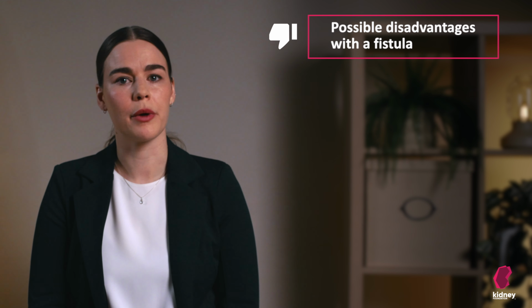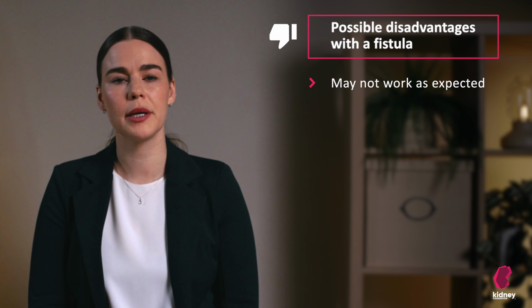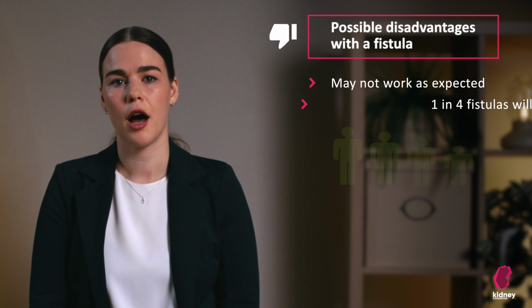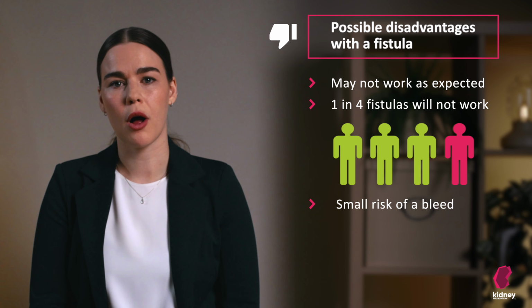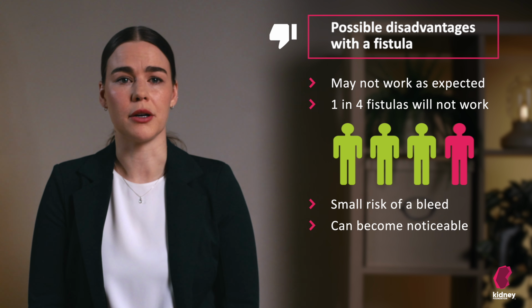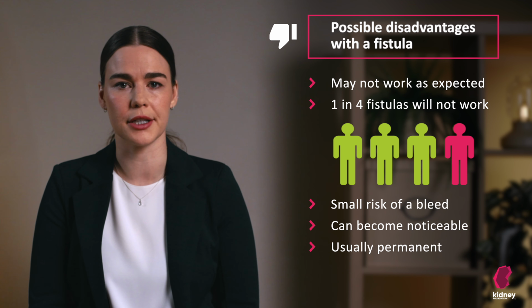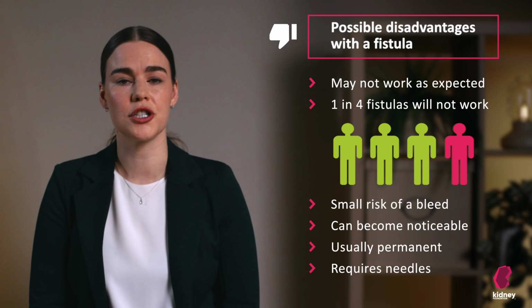Possible disadvantages with a fistula. Sometimes fistulas don't work as expected, or people don't tolerate them well. In that case, we can repeat the surgery or change the type of access. About 1 fistula out of 4 will not work. There is a small risk of a bleed with a fistula. The fistula can be big enough to be noticeable in your arm. It is usually permanent, although a surgery can be done to remove it if absolutely necessary. When you have a fistula, 2 needles are inserted at each dialysis session.